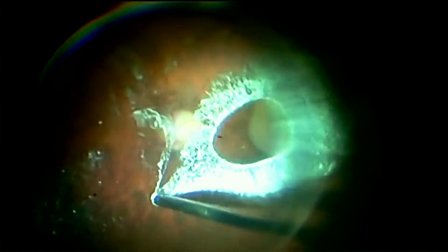A low IOP vitrectomy was performed with the IOP set at 8 mm mercury. The thickened sheath and the occluded central retinal artery could be visualized. A posterior vitreous detachment was induced very carefully since a globe can collapse easily due to the low IOP. The arterial sheath and the central meniscus of Kunt take a faint blue stain with brilliant blue.